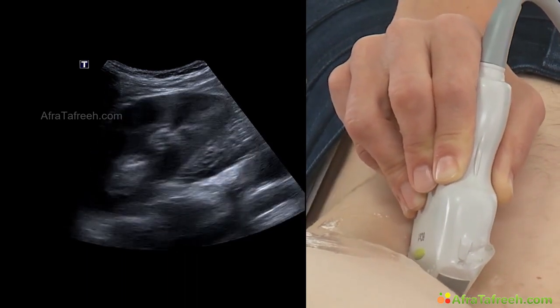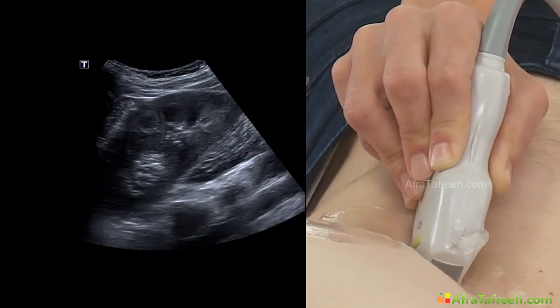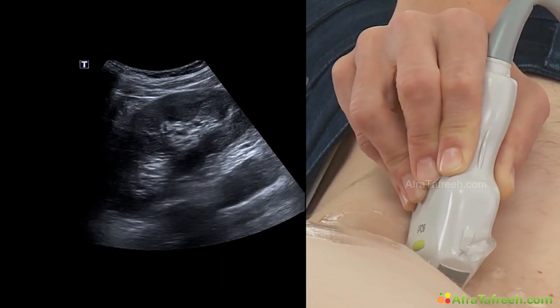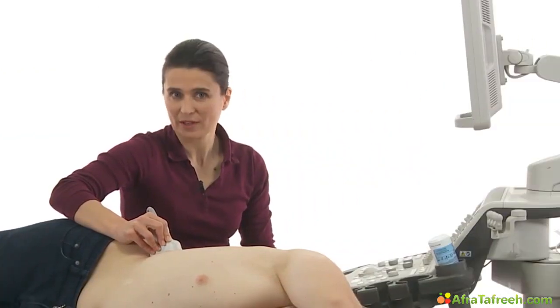Again, I show it again to you. Inhale, please. Thank you. Longest diameter. Then we tilt the transducer from one side to the other until the kidney disappears, so that we are sure to have performed a thorough scan of the whole right kidney.